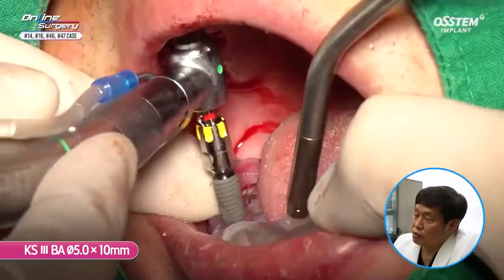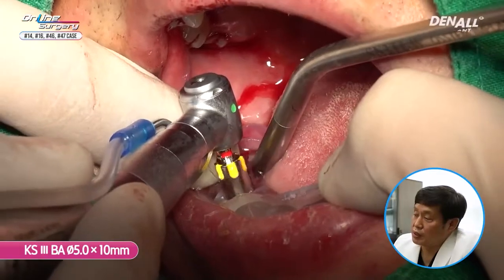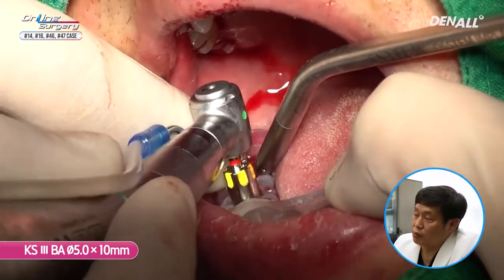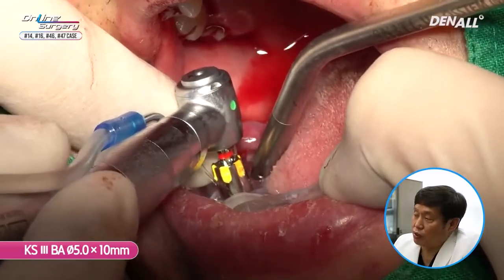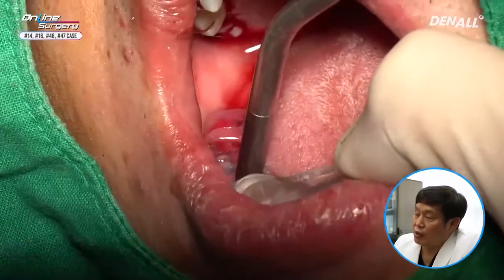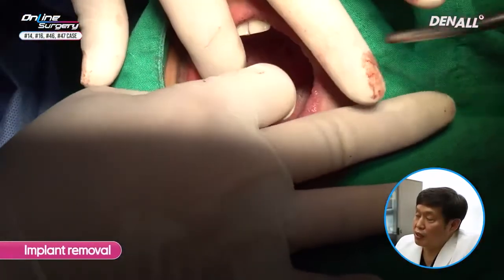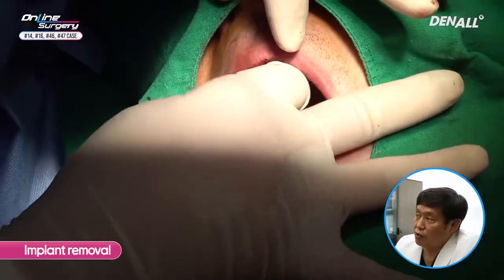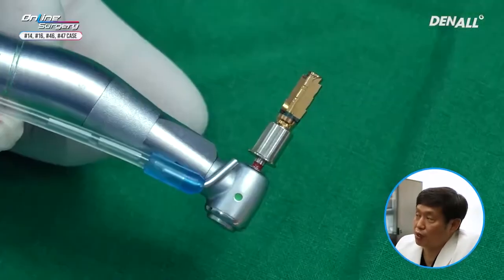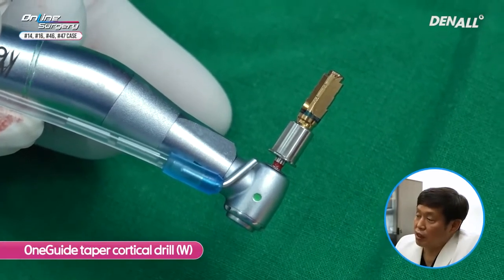I am now placing the implant. KS3BA 5.0 by 10 millimeter implant is used. The bone was harder than expected, therefore the implant did not really go in. I decided to do more preparation. For now, the implant is being removed. If implant cannot be removed on OneGuide template, at times you can remove the template first and then remove the implant.